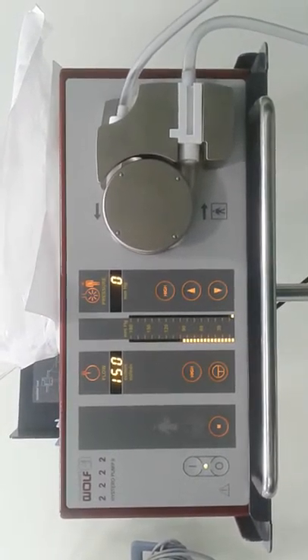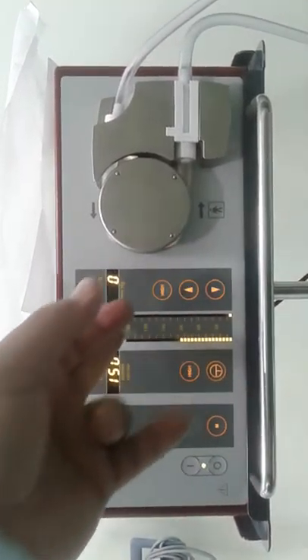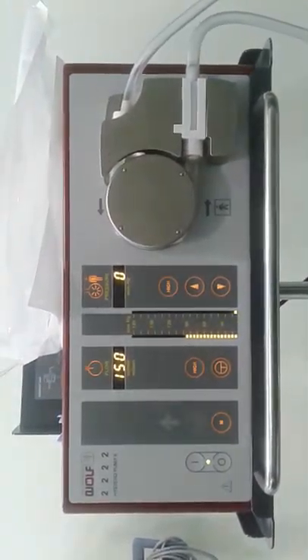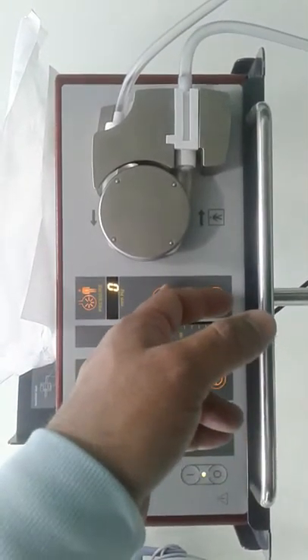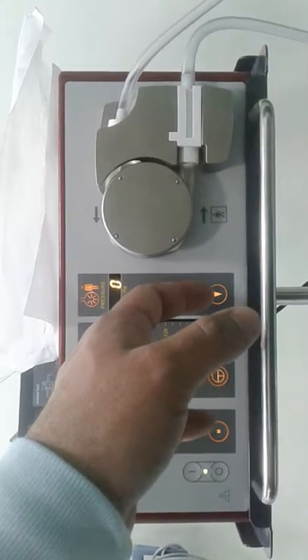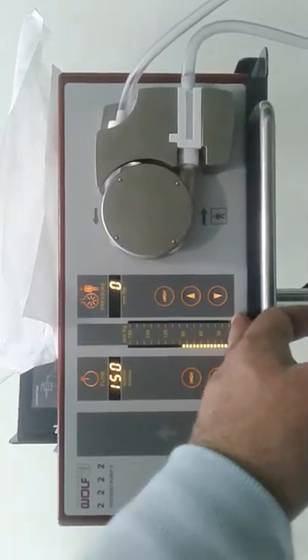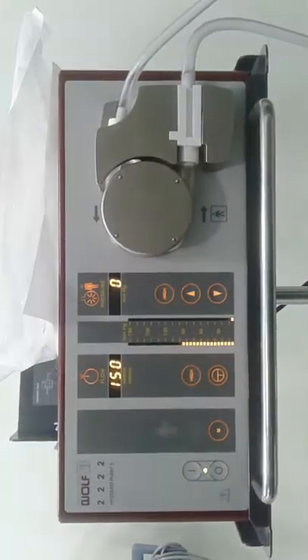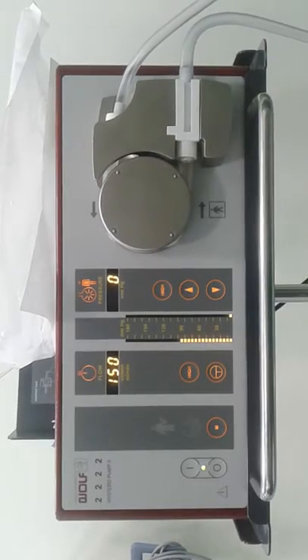When it's inside the uterus, is it shown on the display? We will see it on the display, both. It displays both, nominal and actual pressure. How can we switch to the nominal pressure? It switches automatically, 5 seconds and 5 seconds.